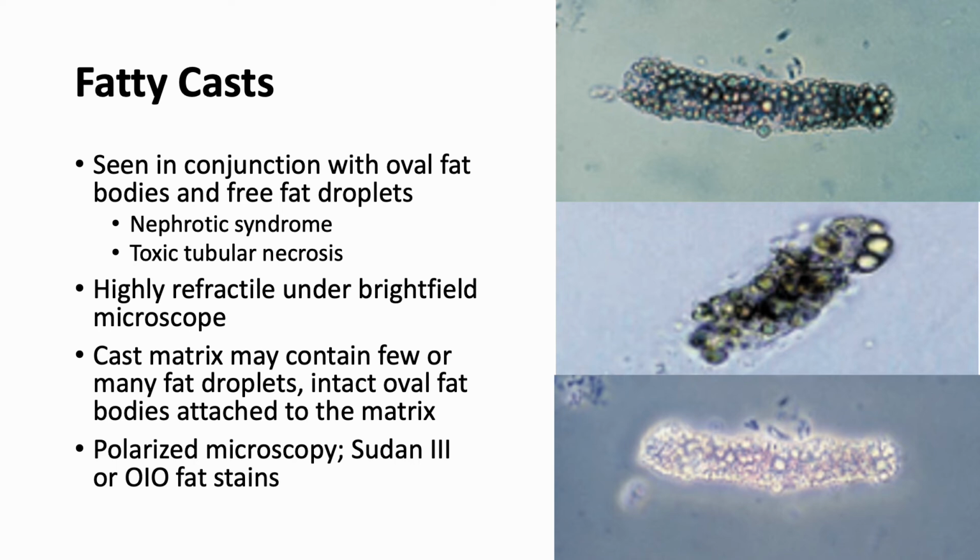Cholesterol tends to exhibit the Maltese cross formation under polarized microscopy. Triglyceride and neutral fats stain orange-red with fat stains. However, the fats do not stain with the Sternheimer-Malbin stain.